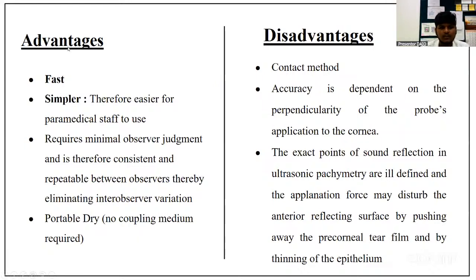The advantages of ultrasonic pachymetry are that it is fast and simple, it requires minimal observer judgment, and is therefore consistent and repeatable between observers, thereby eliminating inter-observer variation. It is portable. There is no need for any coupling medium.